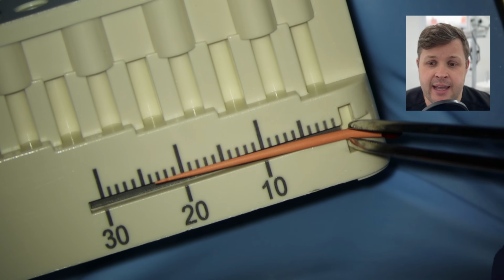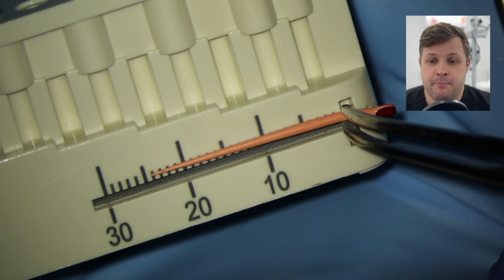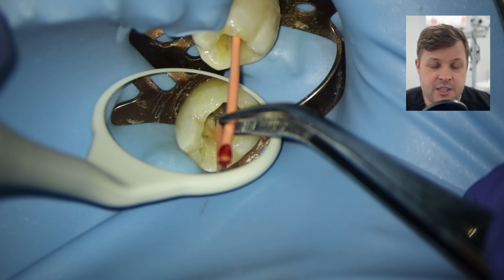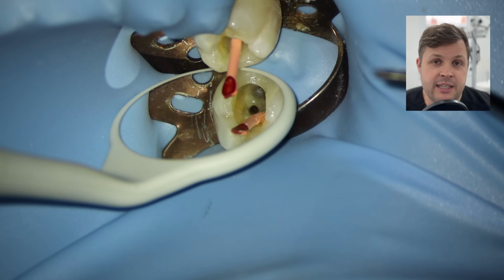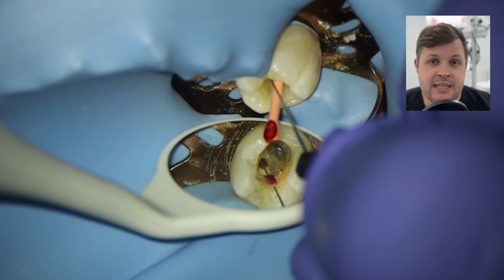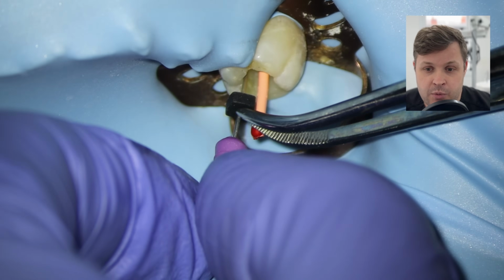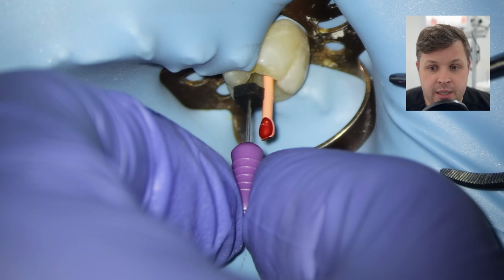So I'm going to take a GP point, I'm going to measure it to 24. I'm going to push this GP point down the mesiobuccal canal. This is going to make sure that I've shaped it correctly and it goes nicely to length, of course. And then I'm going to get a size 10K file. I'm going to place that in the mesiolingual canal, maybe put a little bend on the end. And I'm just going to negotiate this canal near to the working length so I can feel this kind of sponginess.